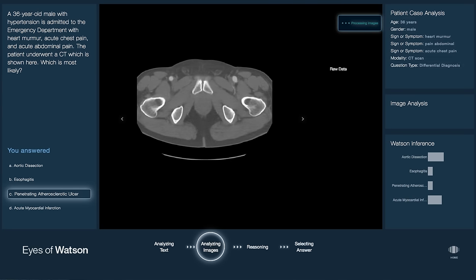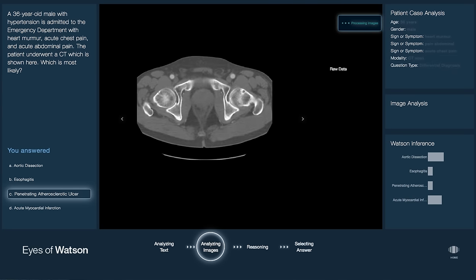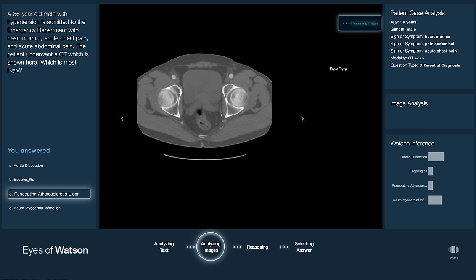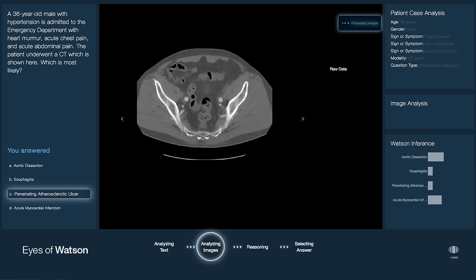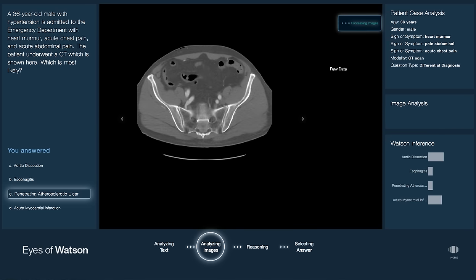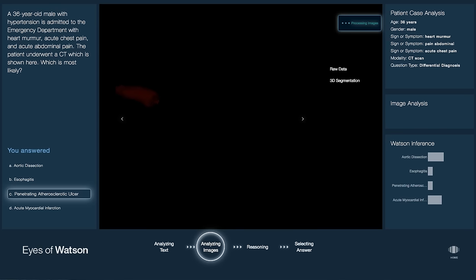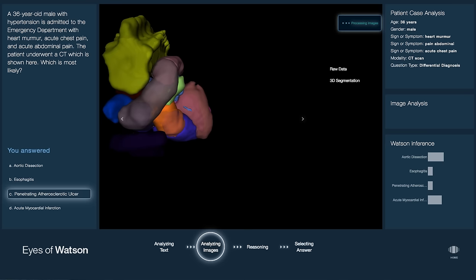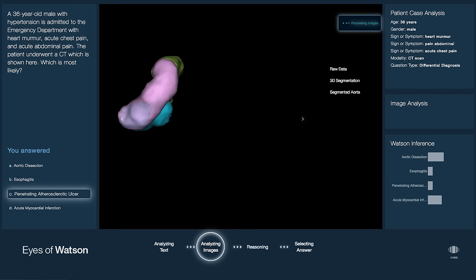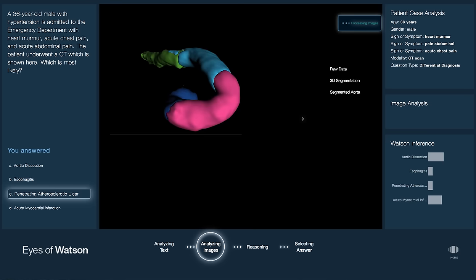Next, Watson analyzes the 3D CT study to first locate relevant anatomical structures visible, such as the heart, the pulmonary artery, and the aorta.